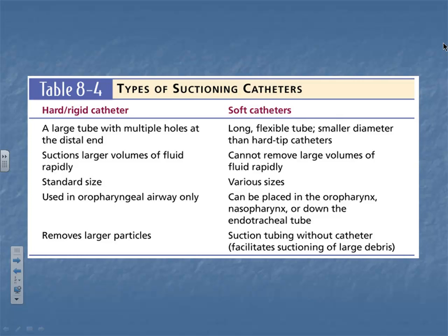All right, you can pull the catheter off, but still my tubing is only this big. I got a hunk of steak this big. Can you see it or can you not see it? You can't see it. I just saw him eat it. How's that? Somebody told me to suction it out. Pull it off. If you can't suction it out, you turn them on their side and you sweep it out this way. Okay. All right.